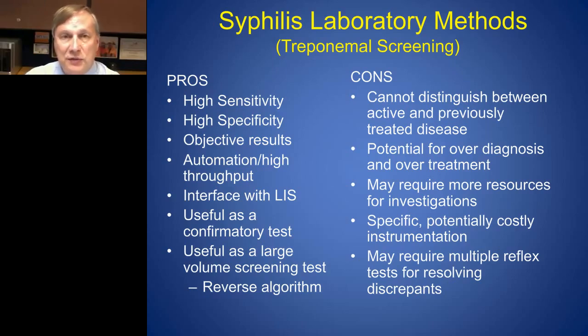They can also be used as a confirmatory test, as can all treponemal tests, and they can be used as a large volume screening assay using the reverse algorithm, or an alternate algorithm, if you will. And we're going to talk about this reverse algorithm when we get further down in the presentation. The disadvantages, they can't distinguish between active and previously treated disease. Again, once you're reactive with the treponemal test, you're generally reactive for life. So if you were screening with just a treponemal assay, that would create a potential for overdiagnosis and overtreatment. And it might require more resources for investigations.